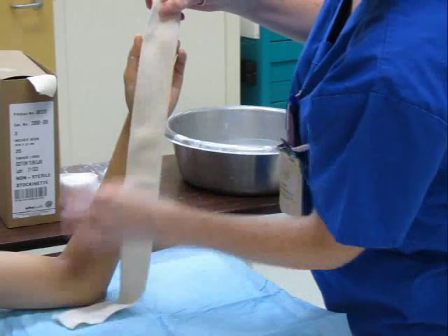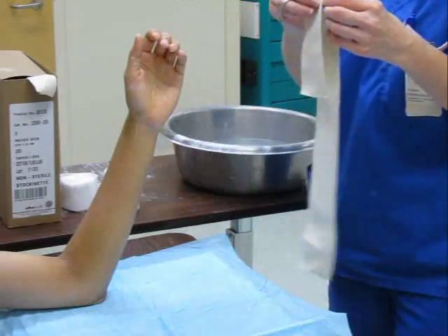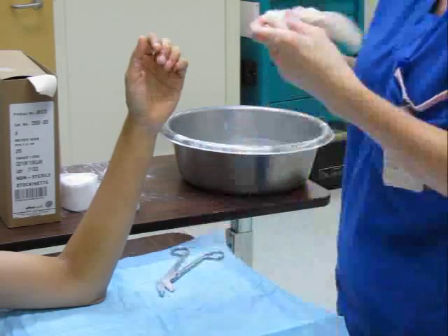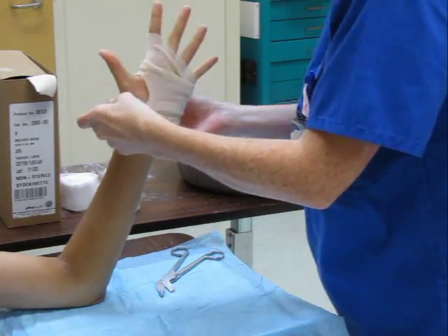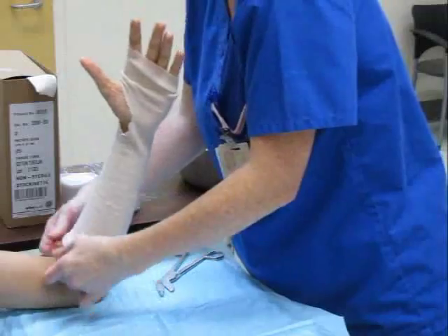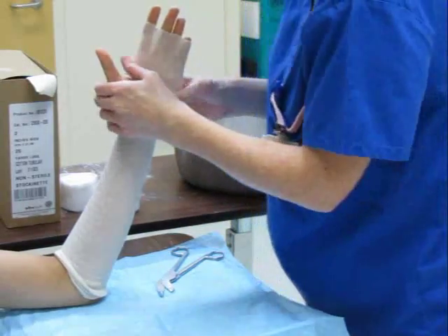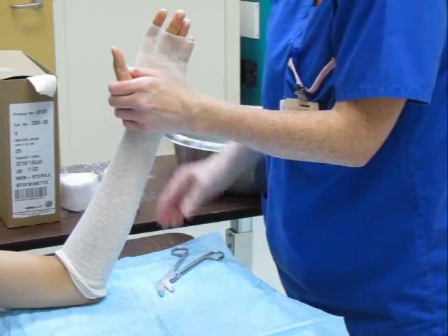Measure an appropriate length of stockinette to ensure full coverage of the forearm. Cut a thumb hole at an appropriate point in the stockinette. Roll the stockinette onto the arm up to the elbow crease, avoiding bunching which could irritate the underlying skin after the plaster is applied. The wrist should be kept as close as possible to the desired final position throughout.